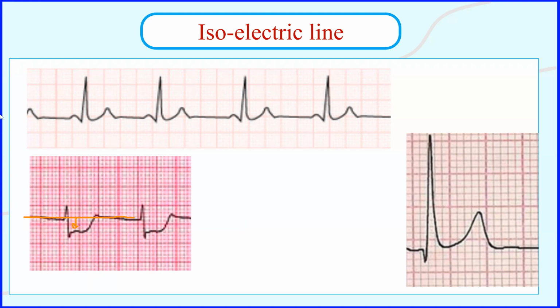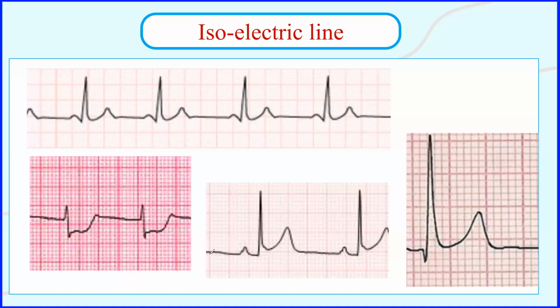And what about this one here? If you can see, guys, we can't rely on this one. We go with the line between the T and the P wave, and we have this line here drawn like this. So as you can see, the PR is depressed and the ST segment is mildly elevated, okay? If we look at the line like this, there is elevation and some depression. So there's ST elevation here and PR depression, but the ST elevation is not very prominent.